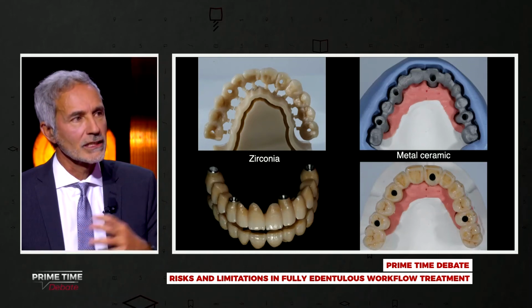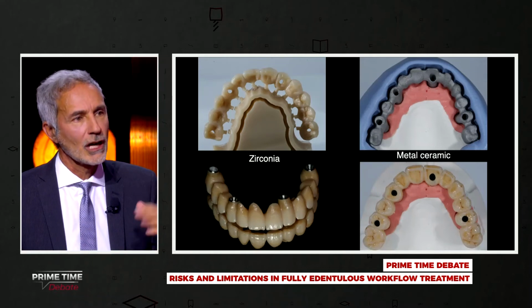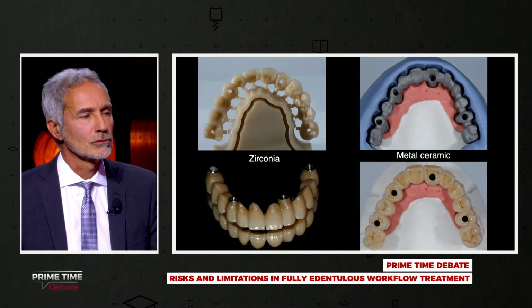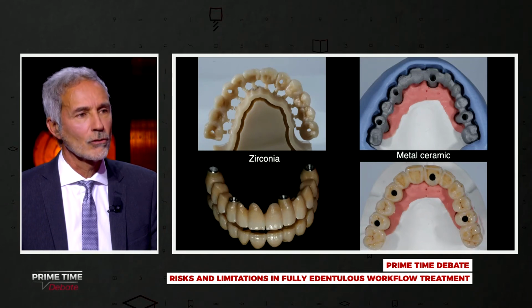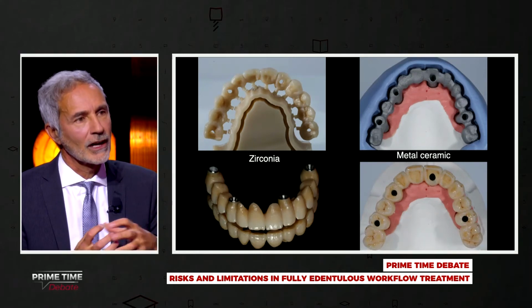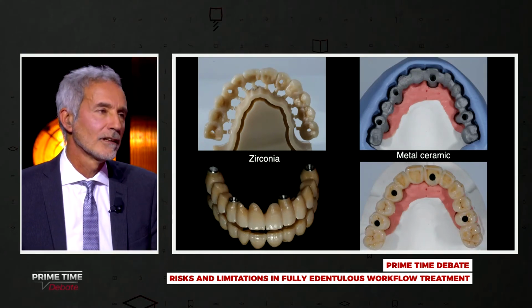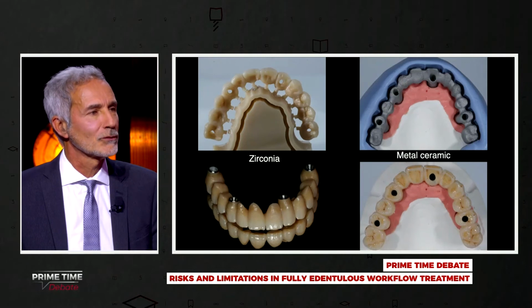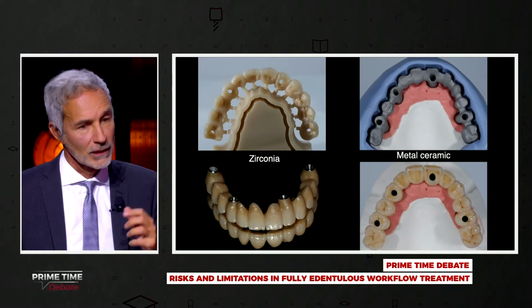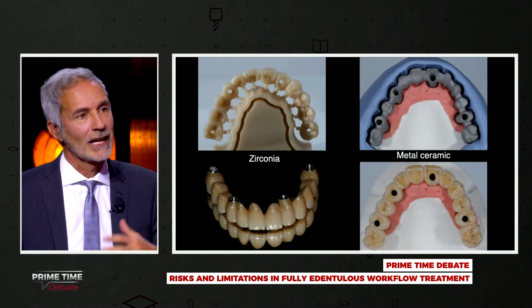If I have both arches, upper and lower, it is very difficult to perform a zirconia or a ceramic bridge because the cleansing of the arch is not very beautiful to hear, and so this case can be solved sometimes with the metallic framework and composite.